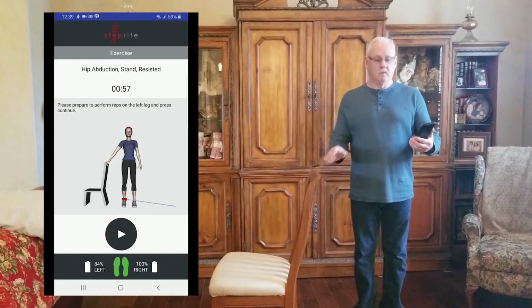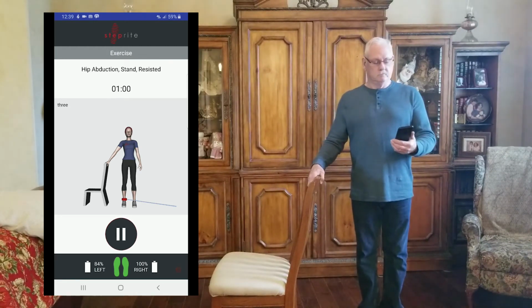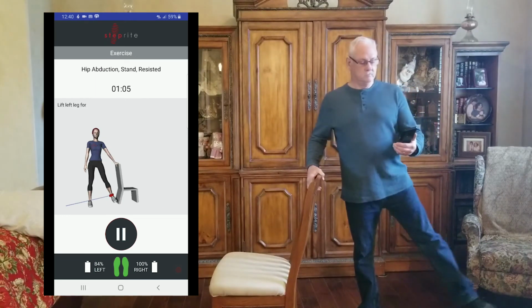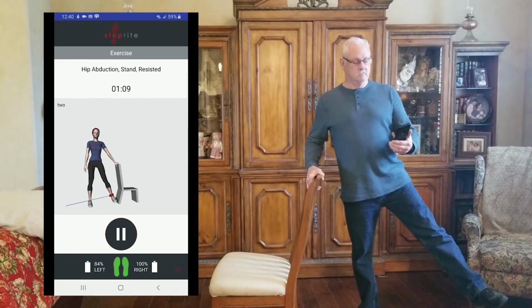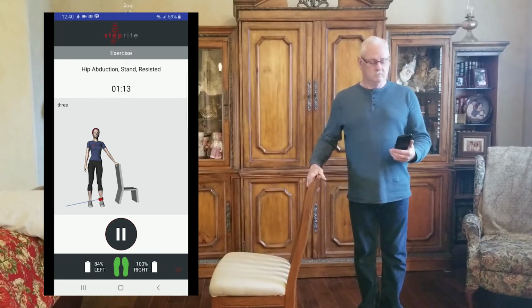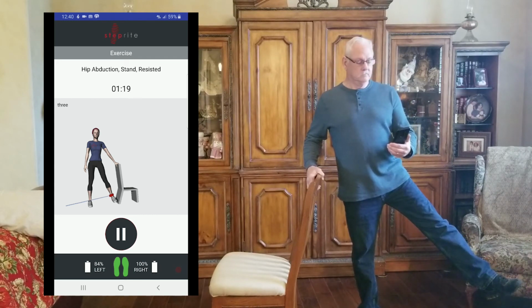As you advance through this, you may not want to watch the video repeatedly if you know how to do the exercises, which is okay. You can simply click the back button to advance to resume exercises. Here again, you will see the 3D animated image move in synchronization with the verbal commands. You as the patient would move in sync with those commands that you see and hear on the app.